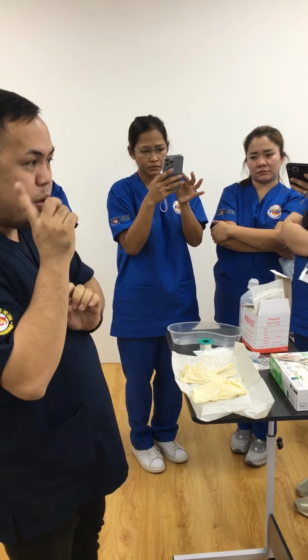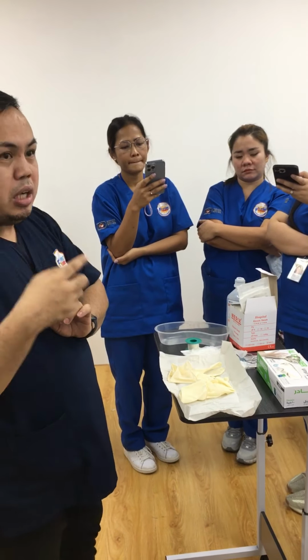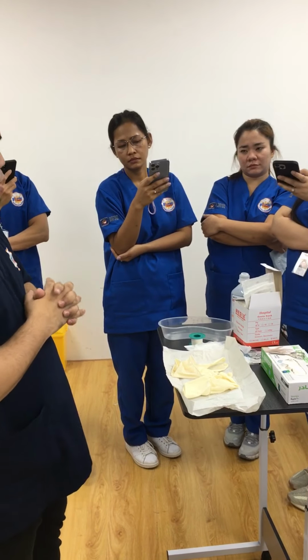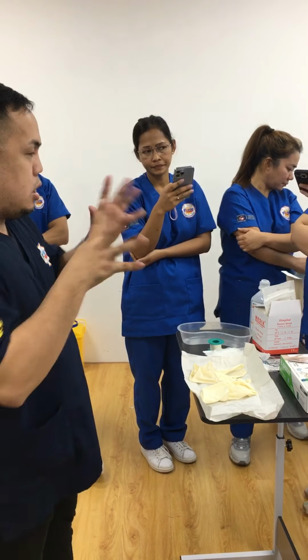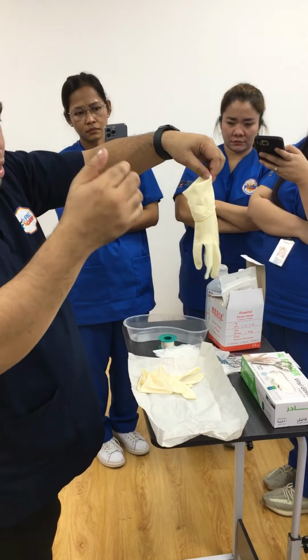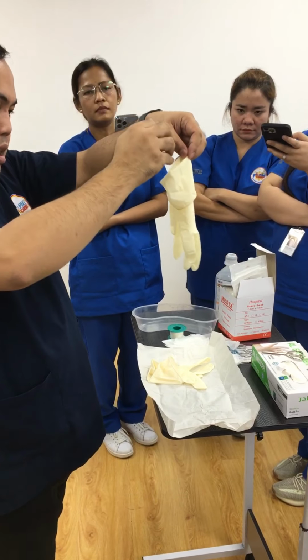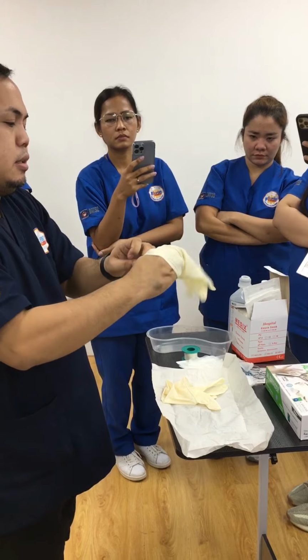Because again and again, you cannot see these microorganisms. You cannot see the infection. They're like, ay, it's okay. Wala pang 3 minutes, wala pang 2 minutes, okay lang yan. Okay, nakikita mo ba yung mga dumi? Hindi, right? So, unsterile part is my hands. So, I have to touch the unsterile part and then check how to insert the proper placement of my fingers. Then I have to insert it.